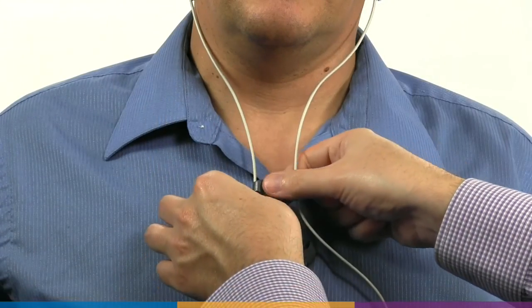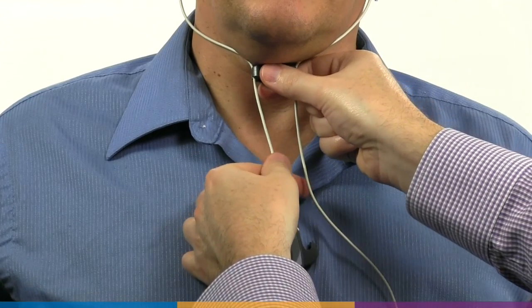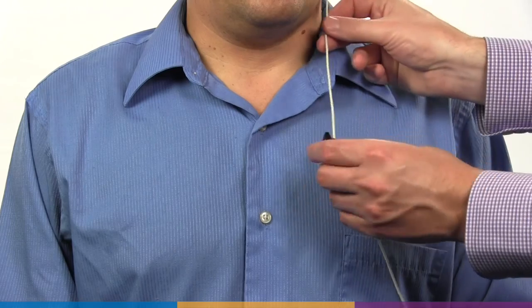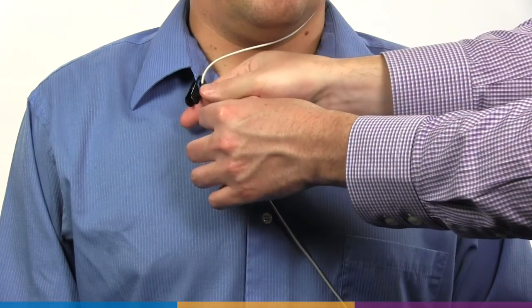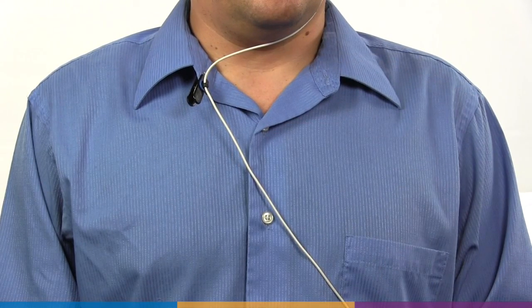Use the probe cable's adjust clip to take up slack in the cables where necessary to ensure correct positioning. On Axiom, RM500SL and Legacy Verifit, affix the clothing clip to the patient's clothing on the opposite side of the body to maintain the probe module's position against the cheek.